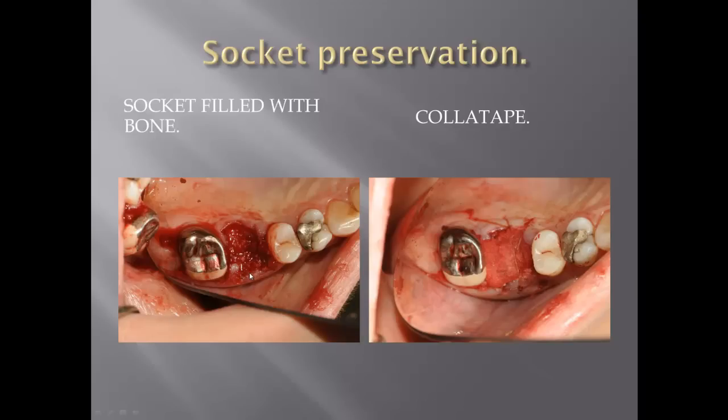On the next step, again, I don't overfill the socket, and I don't pack it so hard, so I make sure I have enough blood supply. Usually bone grows a millimeter a month, but in this area, because five walls are intact, it grows faster, so you don't have to interfere with the blood supply in this area. I use collagen tape. Some people use a different material.